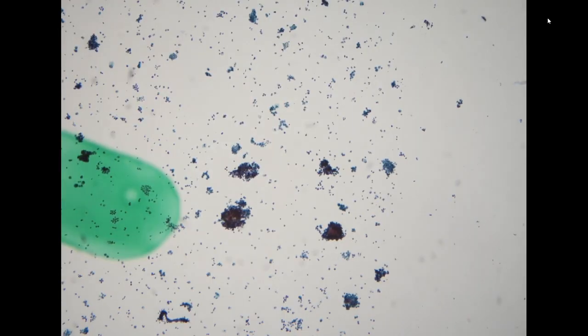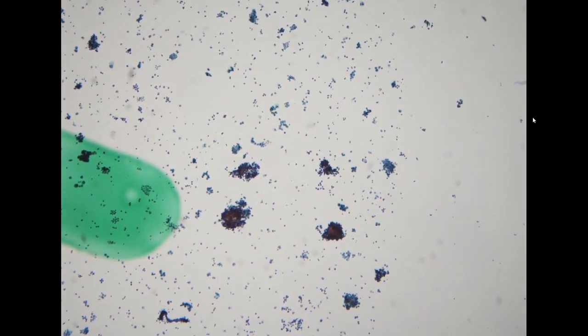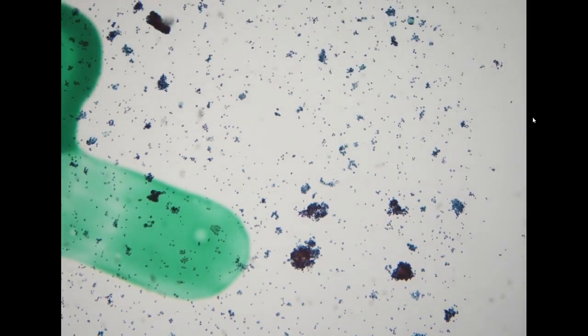Okay, so this is the urine from an 82-year-old. He received ureteroscope, and the clinician found out that in the left ureter there is a tumor. So this is the washing cytology for left ureter.